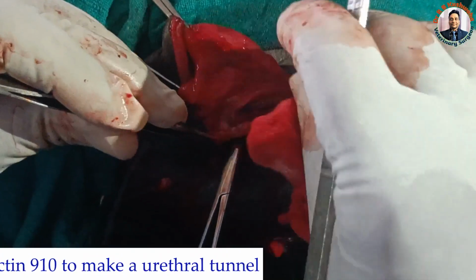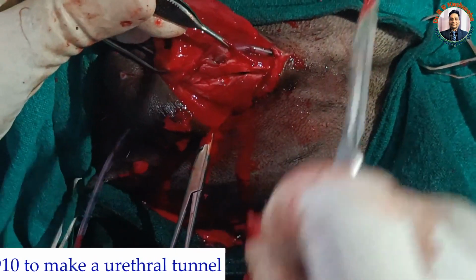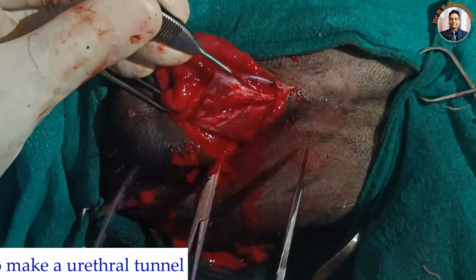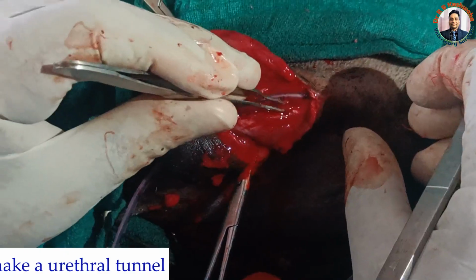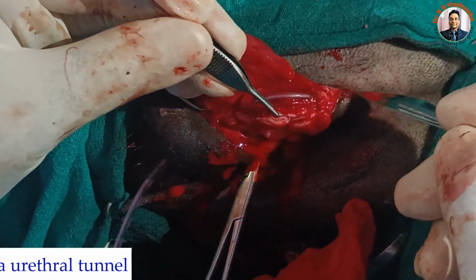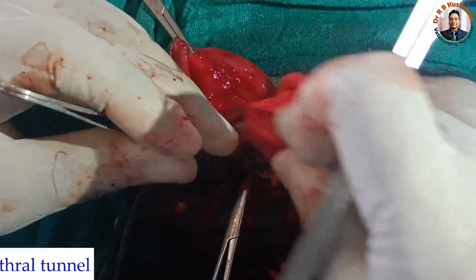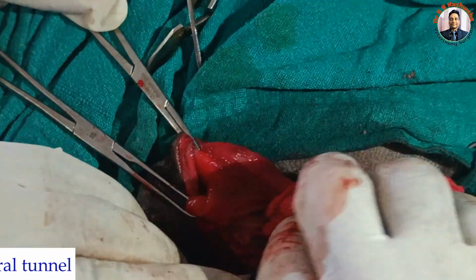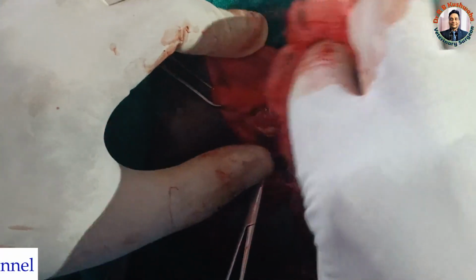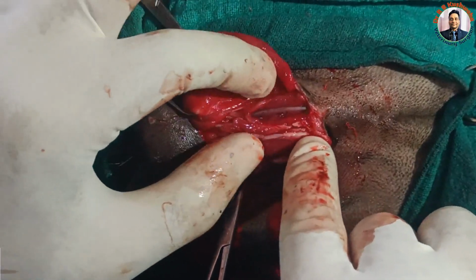Now it is much clearer. So in this way we have prepared the urethral mucosa for the repair over this catheter.